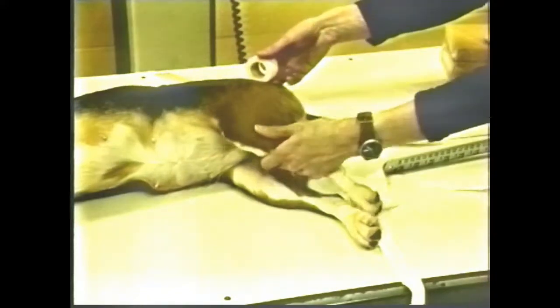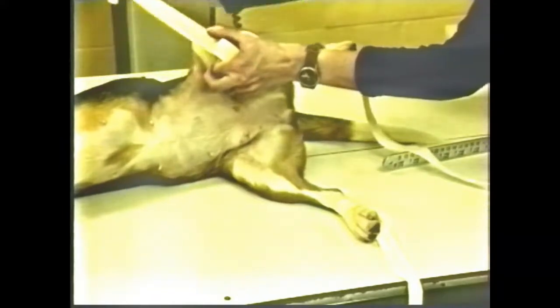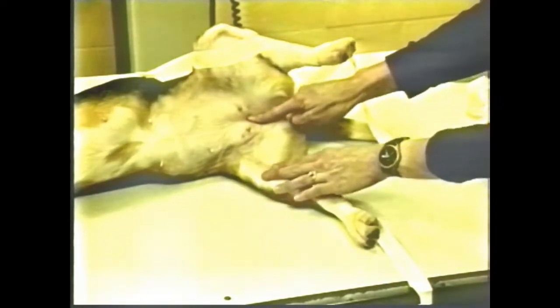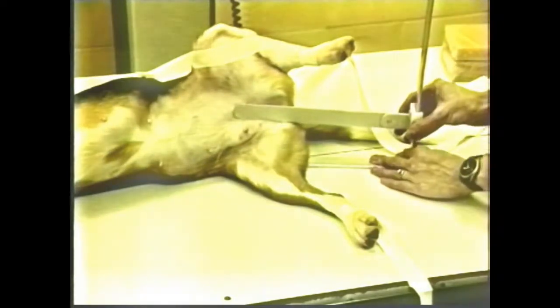To obtain a lateral view of the femur, the animal is placed in lateral recumbency with the leg of interest down on the table. The other leg is taped and pulled out of the way. This prevents the superimposition of the other leg over the prime leg of interest. The beam must extend from the acetabulum to the stifle. The measurement is made in the hip area, which is the thickest part and must be the determining factor in establishing the technique.